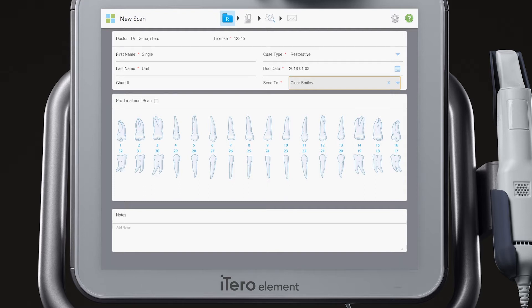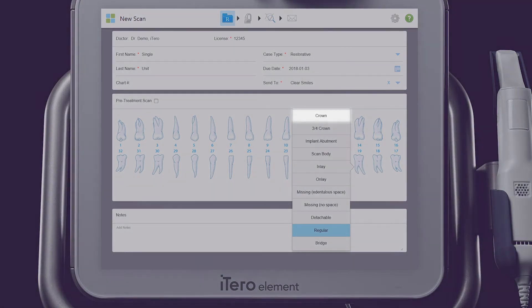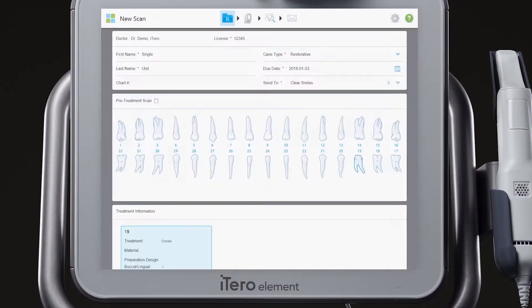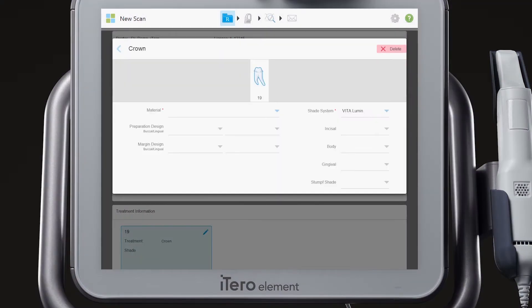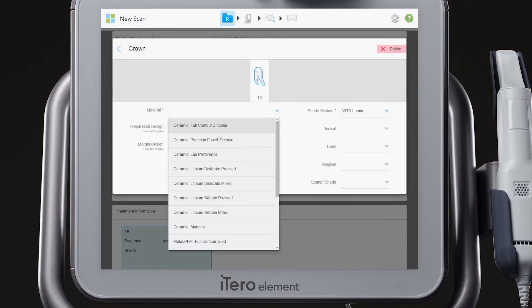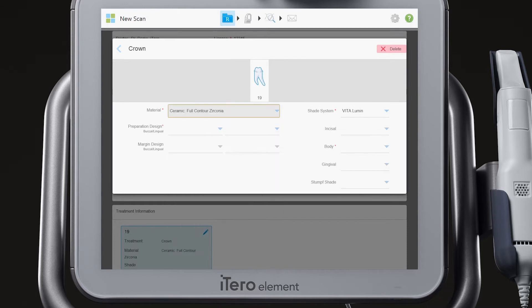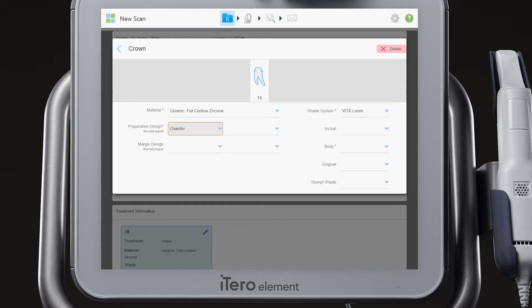Choose the tooth number from the tooth diagram. Select the restoration type from the list. Complete the restoration details such as material, preparation design, shade, and body.